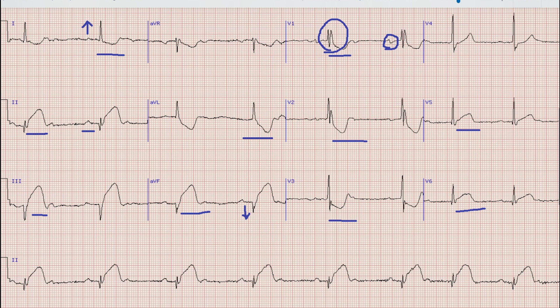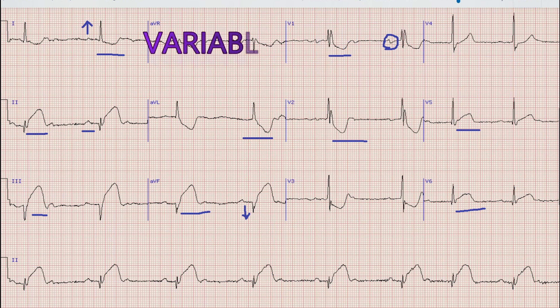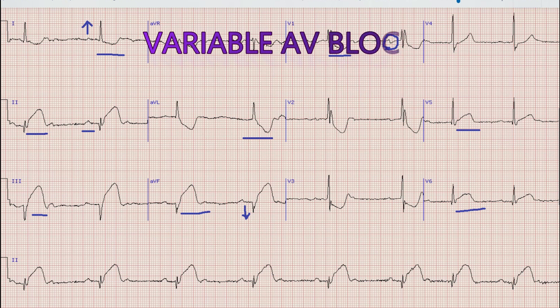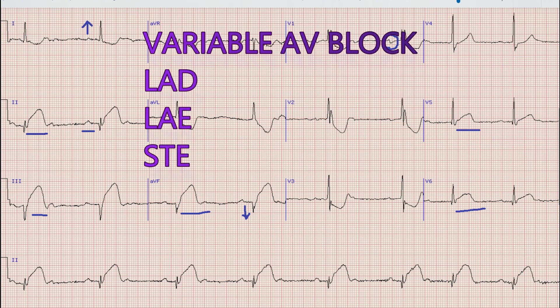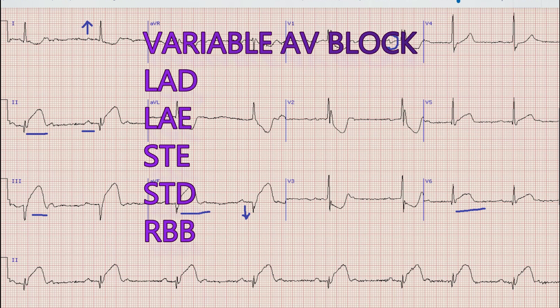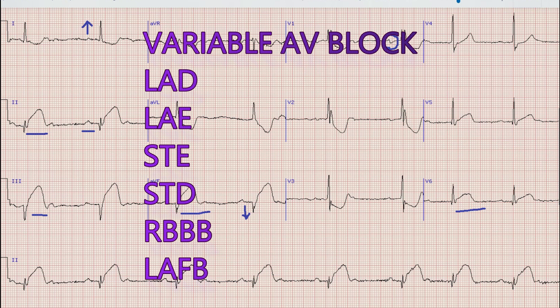So summarizing the findings: there is sinus rhythm with variable AV block, there is left axis deviation, there is left atrial enlargement, there are ST elevations in leads 2, 3, aVF, V5, and V6 with reciprocal ST depressions in leads 1, aVL, and V1 to V4, there is right bundle branch block, and there is left anterior fascicular block.